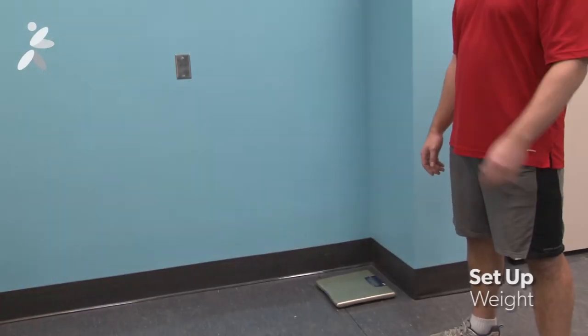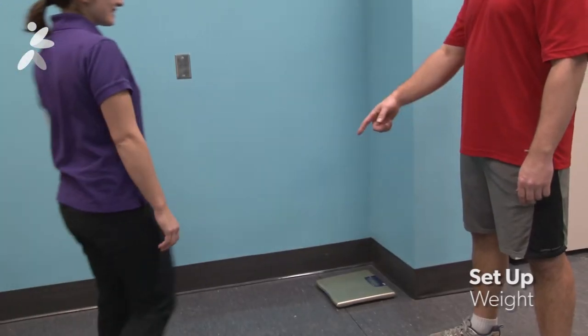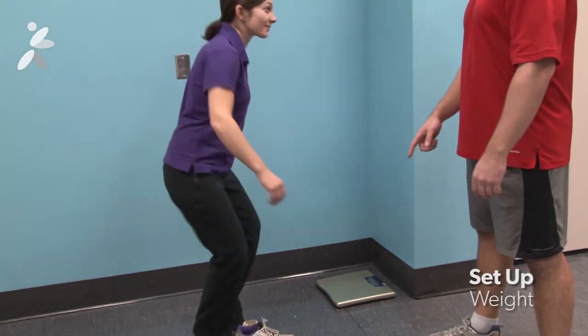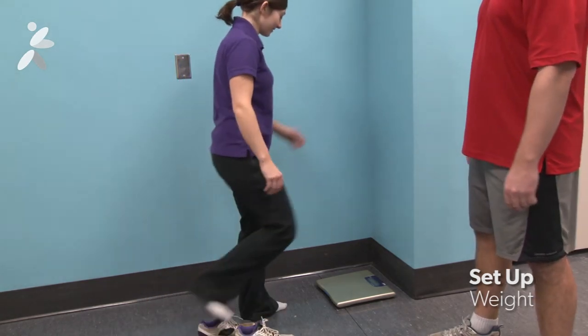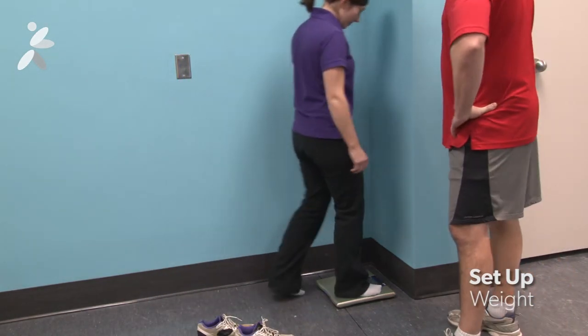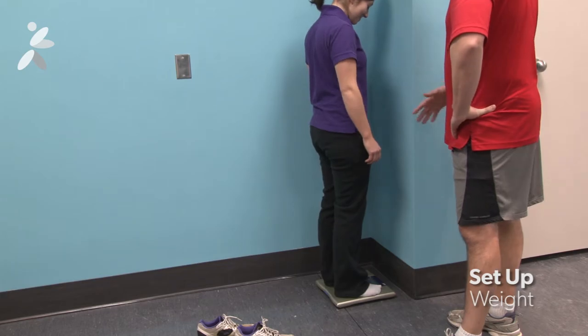Place the scale on a smooth level section of the floor. Ensure participants have removed footwear, socks are kept on, and are dressed in lightweight clothing.